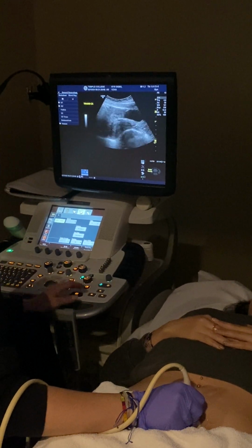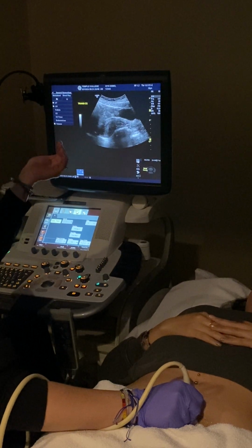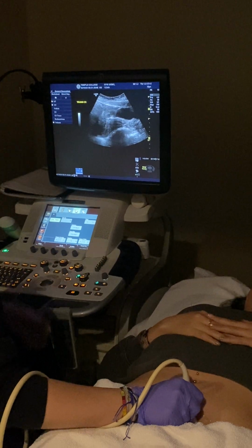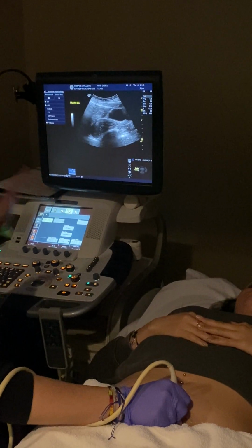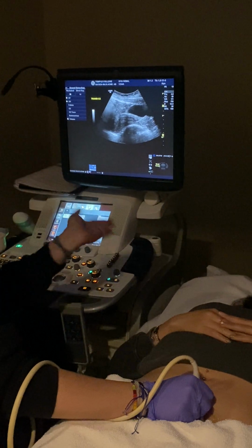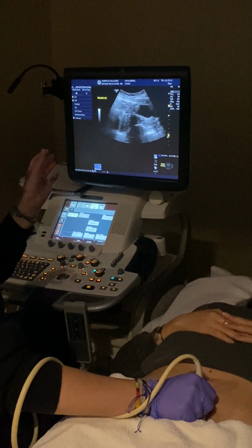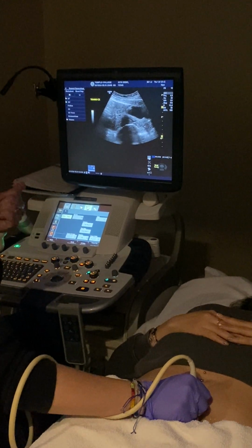Okay. And it's very possible that all this bowel has pushed her uterus that way. She clears her bowels, it might antiflex and go back that way. So the uterus can change its shape somewhat as you're scanning. I've been doing a vaginal scan and the uterus has gone from anteverted to retroverted as I'm scanning. So depending on how loose the ligaments are in there holding everything together, it can kind of move around a bit.